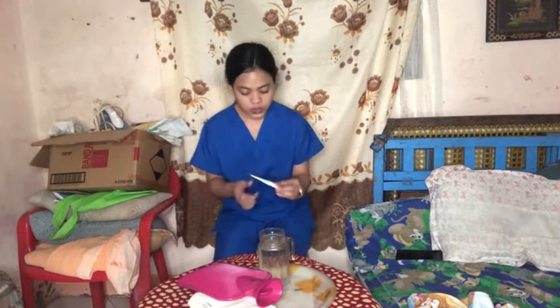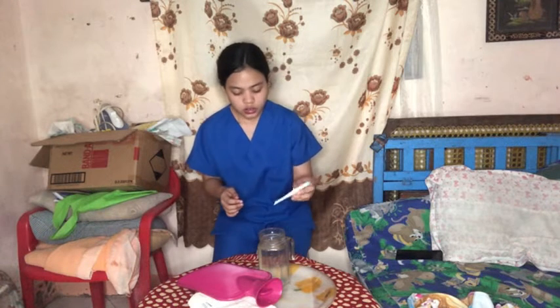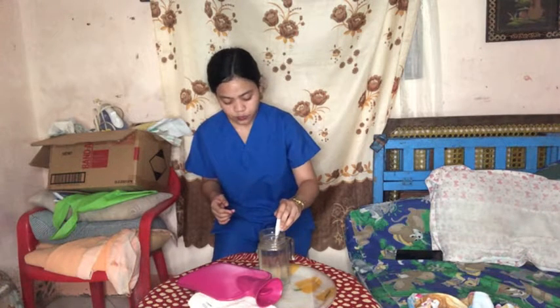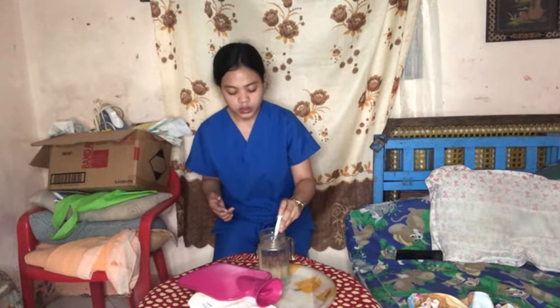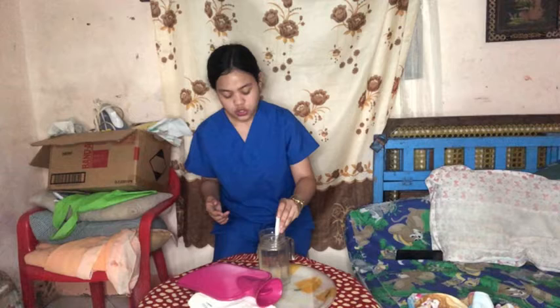So first, we need to measure the temperature of the water using the bath thermometer. I'm just going to place the bath thermometer deep in the water. Then let's wait a few minutes until it reaches the maximum temperature.